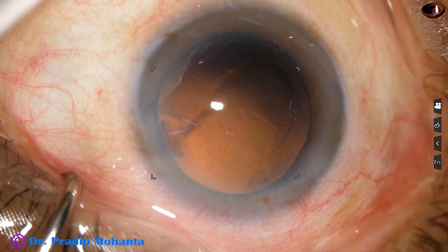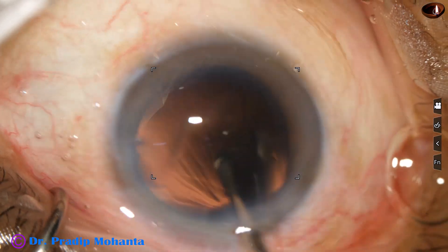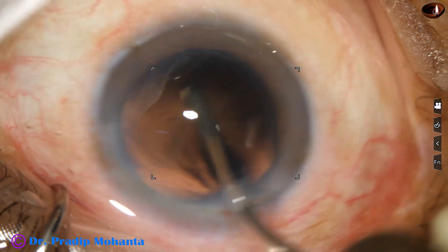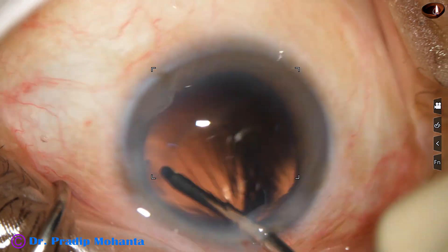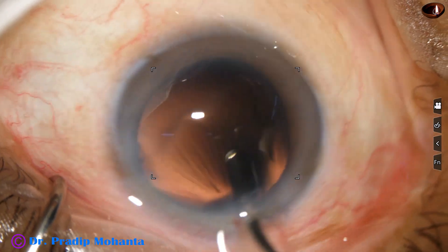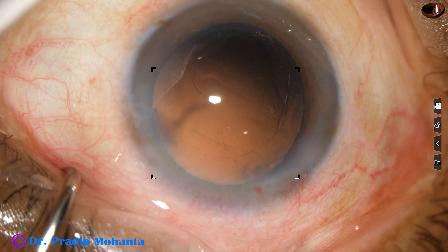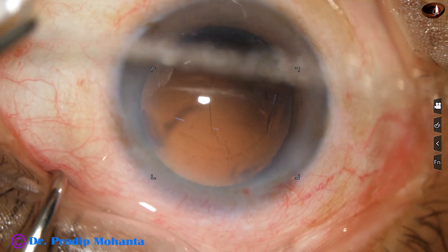Now I take the irrigating probe of bimanual IA and use the irrigating jet of fluid to polish the posterior capsule. We can see a black shadow in the anterior vitreous — that can be a floater.